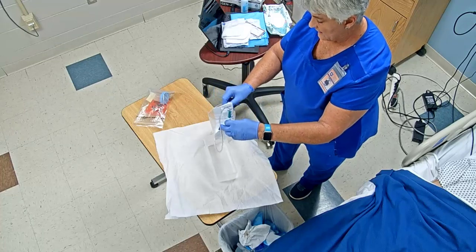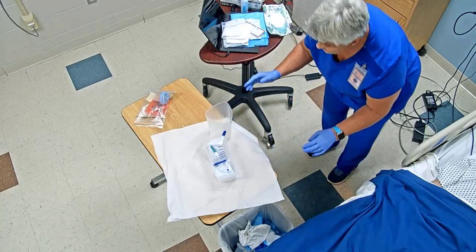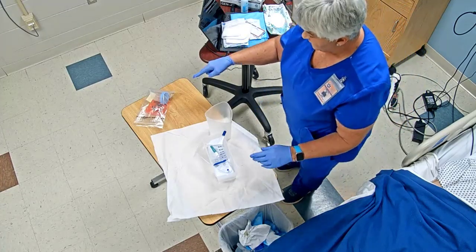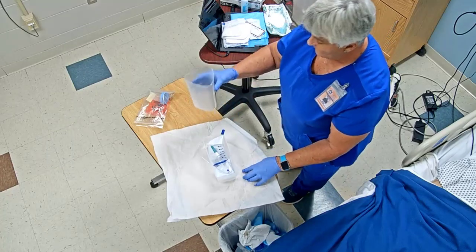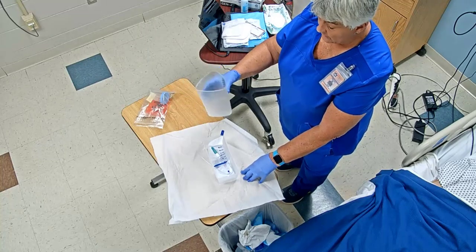So once we've got all that drained in there, then I'm going to go ahead and get eye level. And so there's 200 in there plus the 30, so 230 is what we had. I'm going to be evaluating the color, the consistency, and also the odor.